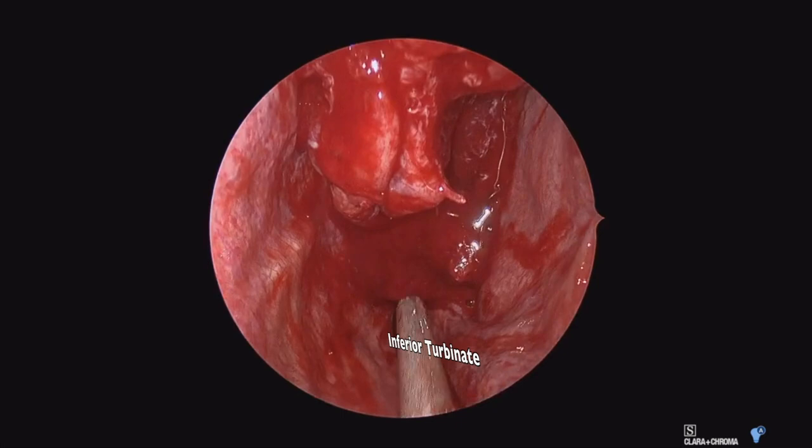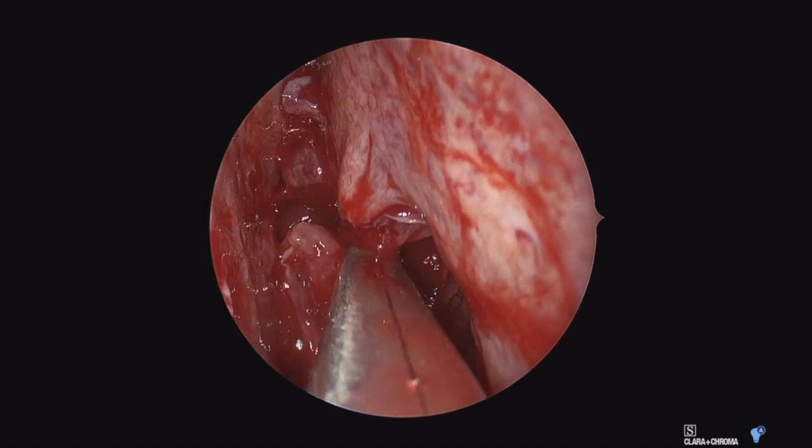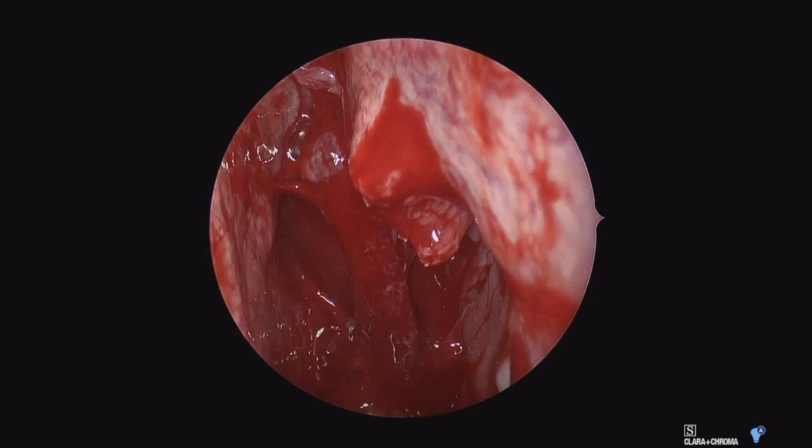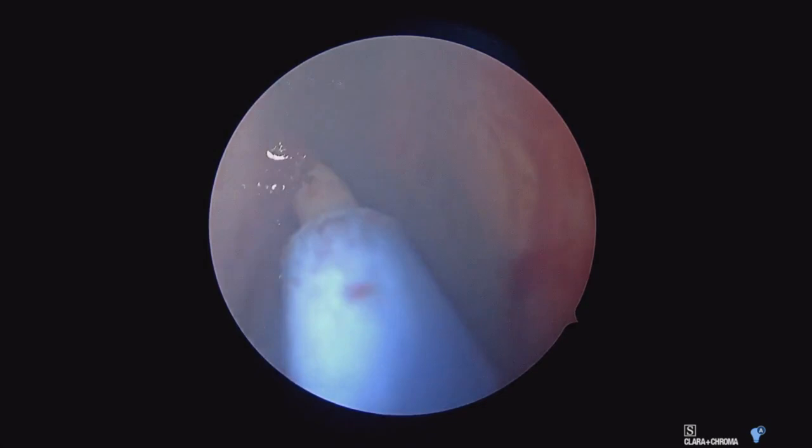Tumor is freed from the lateral nasal wall in the area of the inferior turbinate towards the maxillary sinus. We'll take out the rest of the left middle turbinate, as tumor is involving it. When dealing with sinus malignancies endoscopically, the key is to debulk areas that are freely hanging, then closely assess the mucosal areas it's attached to, and take wide margins around those.